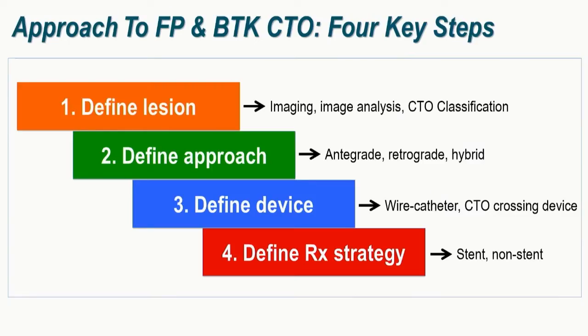One thing I want to point out, which I hope has come through from what our speakers before me have said, is that a crossing strategy is not just a crossing strategy. At least in the periphery, it does impact what happens subsequently in terms of use of atherectomy and overall treatment. In coronary, the DES is the end result of most interventions, but not so much in the periphery. So I think defining the lesion and paying attention to the crossing strategy and how it would impact subsequent treatment approaches is something to consider.